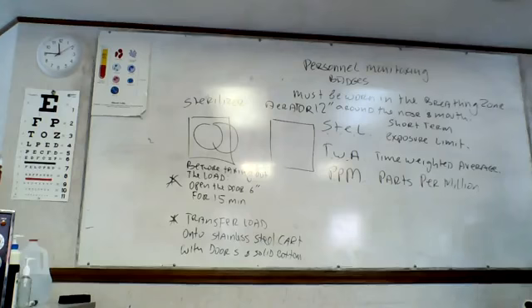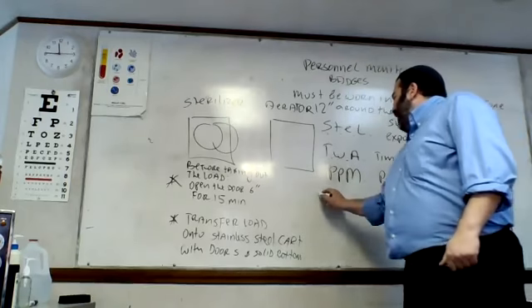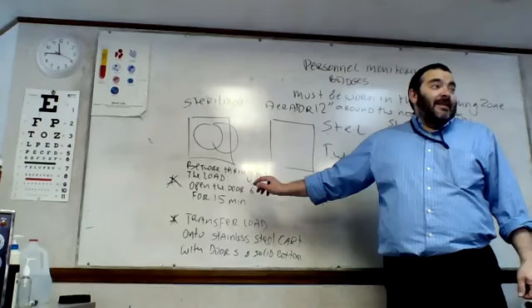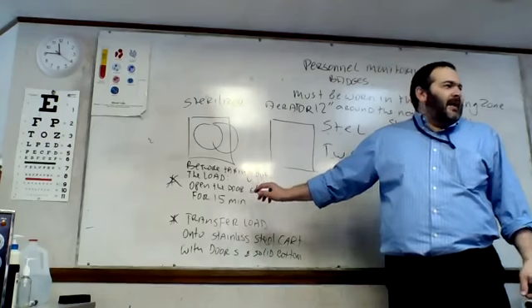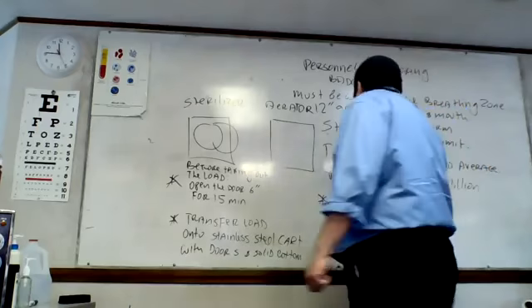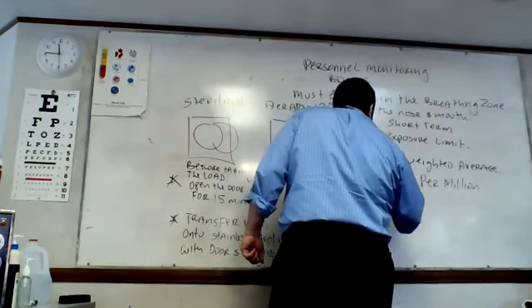But we're not done yet. And here is the kicker. No matter how trivial this may sound, it's on the test. Ridiculous, but nonetheless: pull the cart.